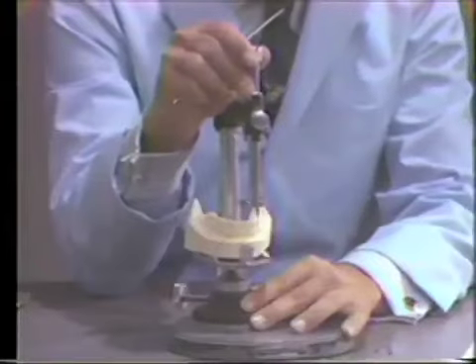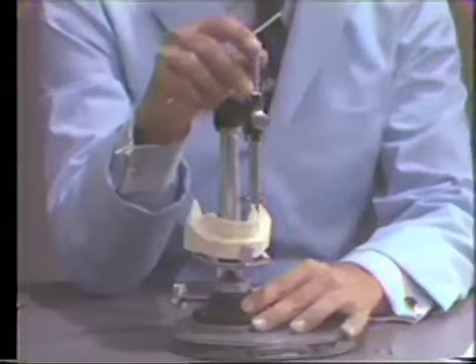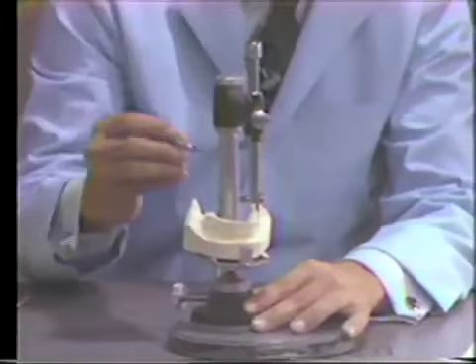Now as I come posterior on that side, I lose that undercut when I lose the effect of the root. As I go posterior, I lose that undercut when the root is no longer underlying. And again, as on the lingual surface, the more apical portion or connection of the soft tissue to the ridge is the greatest diameter, and there is no undercut in the ridge in this area.